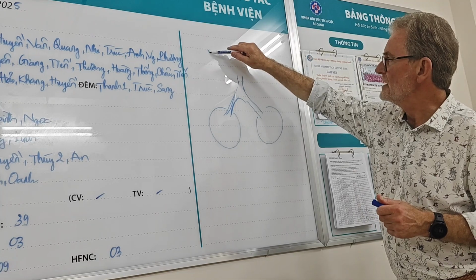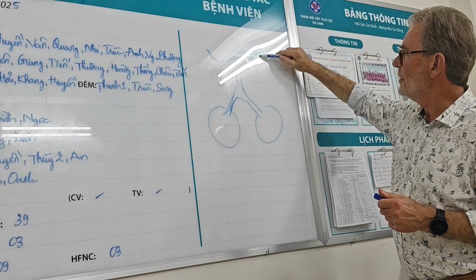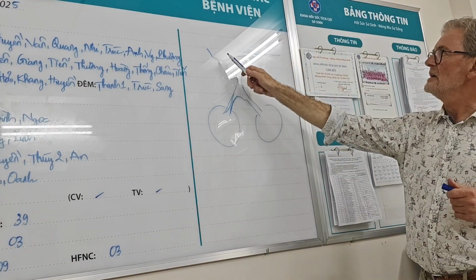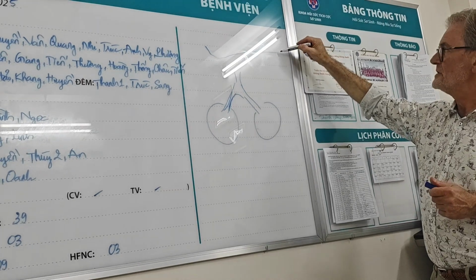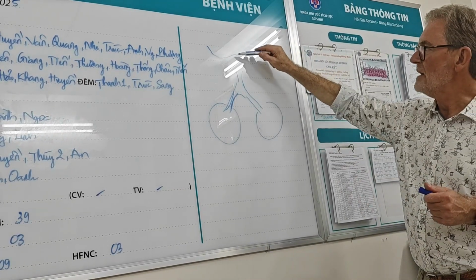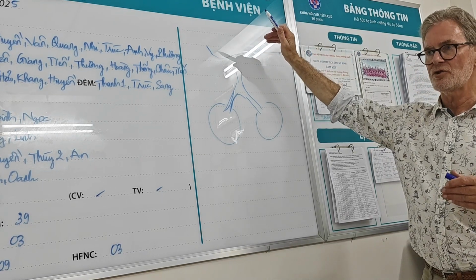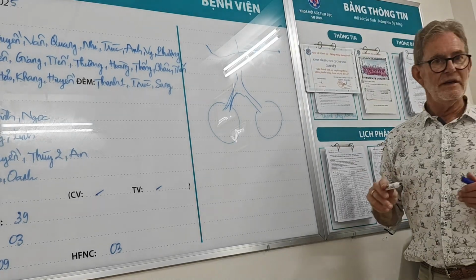And it's the same with exhalation. What happens during exhalation with high airways resistance is you've got this very long tail, and it's not until you reach zero that the lungs empty. So if your expiratory time's too short and your rate too high, you clip it off there.